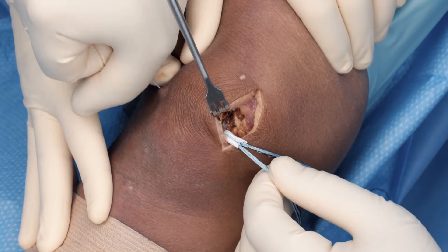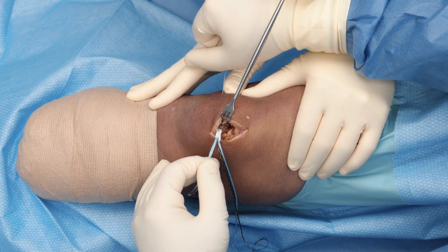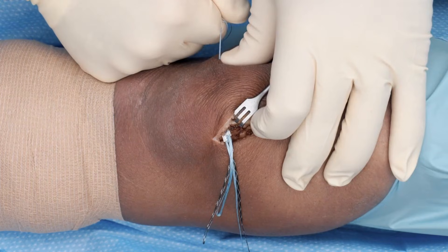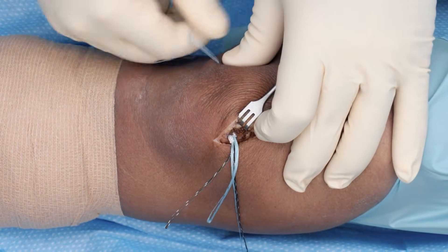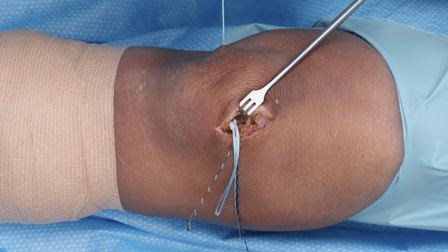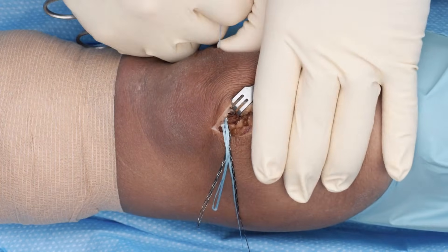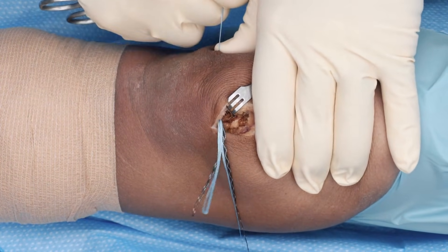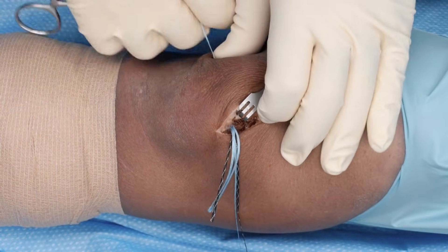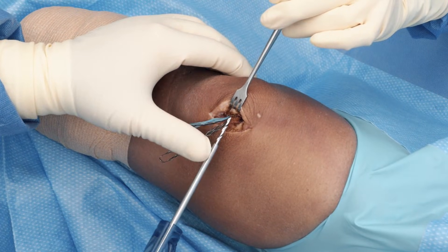All of the force pulling in line with the socket is coming from my pull of the O fiber wire. We've got counter pressure. You can see it's already dunking in a little bit, and you don't have to pull real hard here. It's just a slow steady pull because there'll be gradual relaxation and deformation that allows the anchor to carefully be deployed into the socket. I've placed the first anchor just above the equator of the patella. The second anchor is going to be roughly 15 millimeters superior to that.